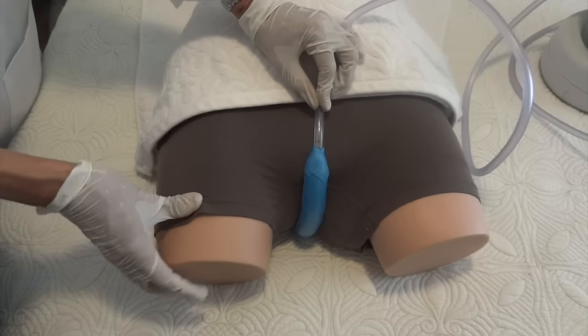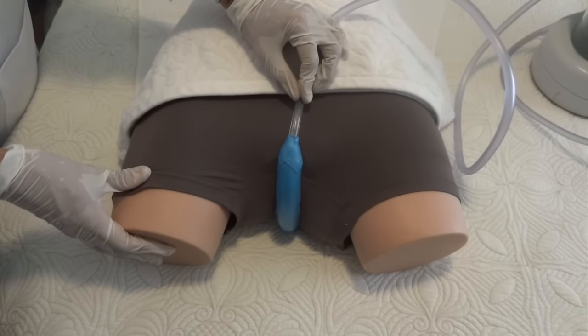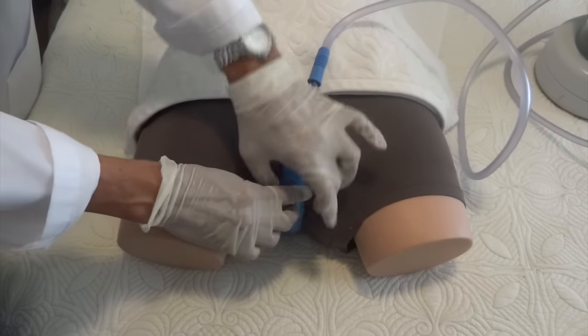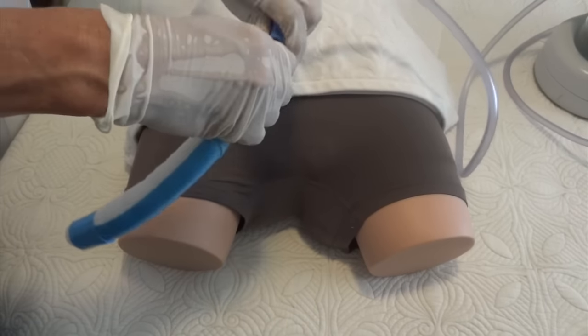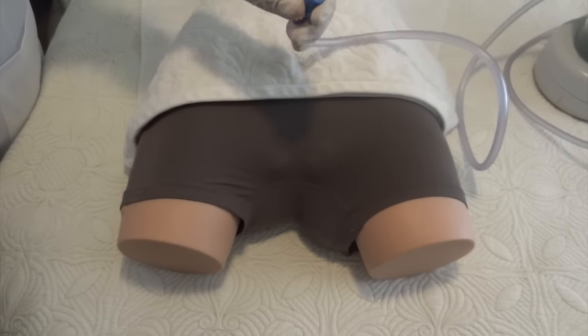When it's time to remove the wick, you again separate the legs, gluteus, and the labia and remove the wick. You can separate the wick from the tubing and dispose of the wick.